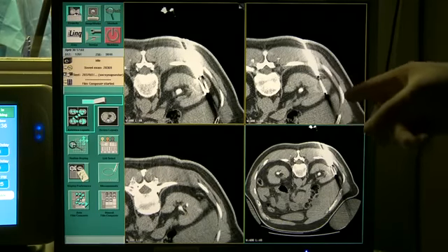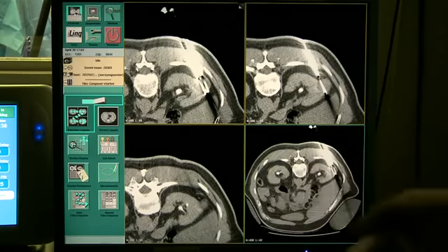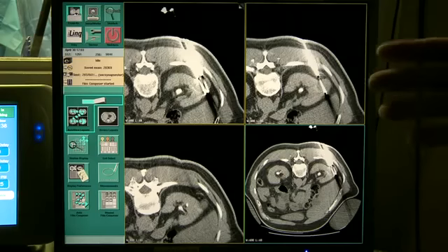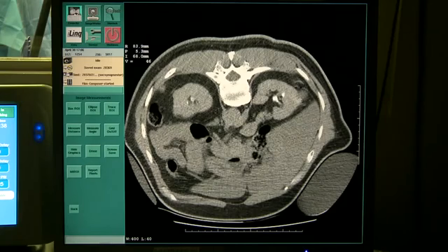I've probably advanced it a millimeter or a couple of millimeters, and you can see the next stop above that is a little bit of tumor. There won't be any tumor above that, so certainly we've treated the upper part of the tumor. Now the only question is, have we treated the medial part of the tumor? So we're going to do a set of pictures through the entire set. So these are the last set of images through the whole of the lesion in both probes.